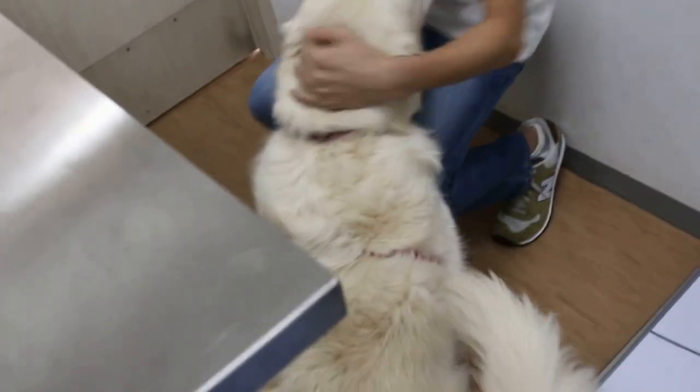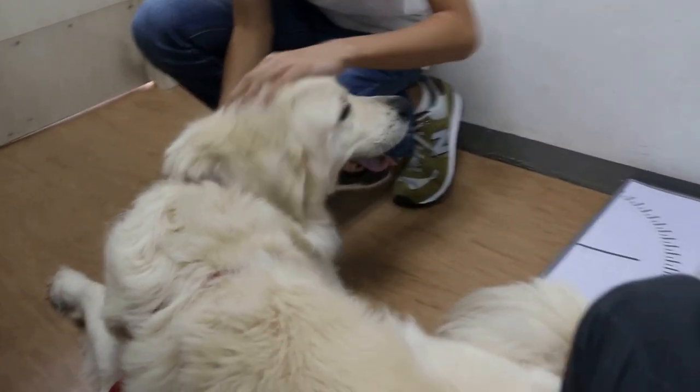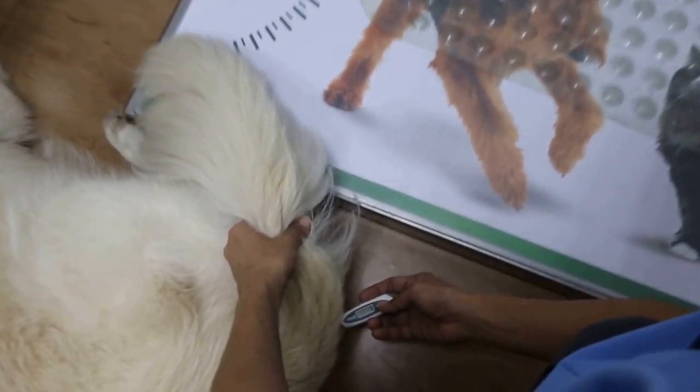Talk to the dog, always talk to the dog. And just show the taking temperature. Just show, go that side. Judy, just let me see. You just need the footage for temperature taking, which we already taken. Just zoom on to it.